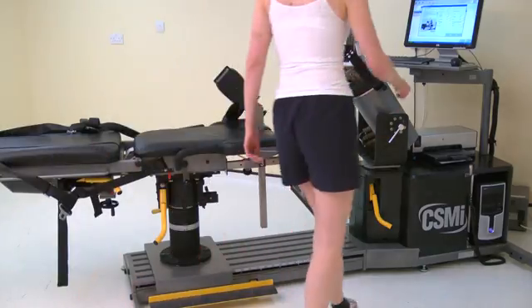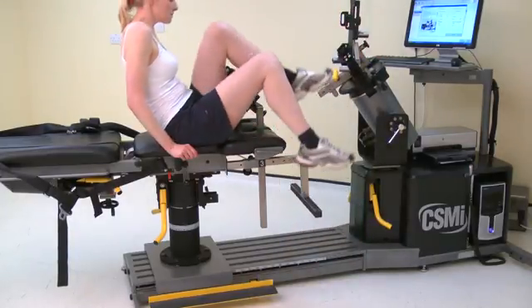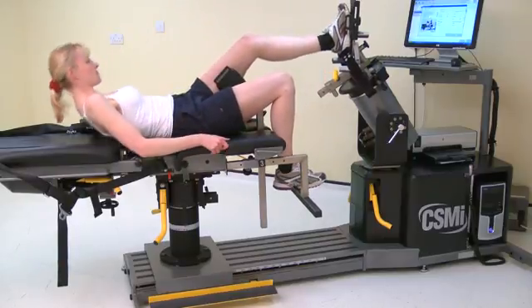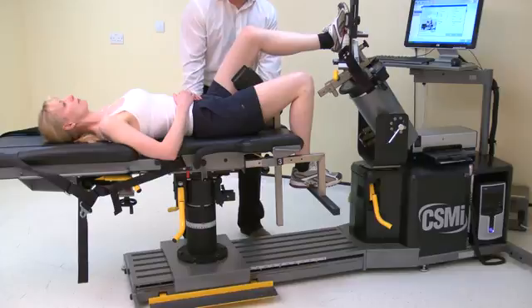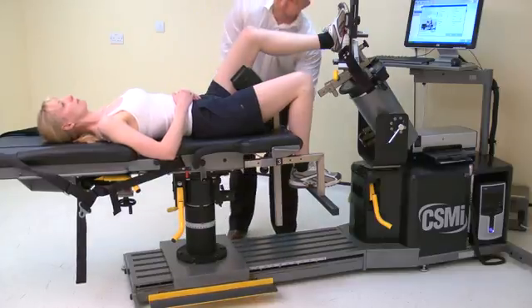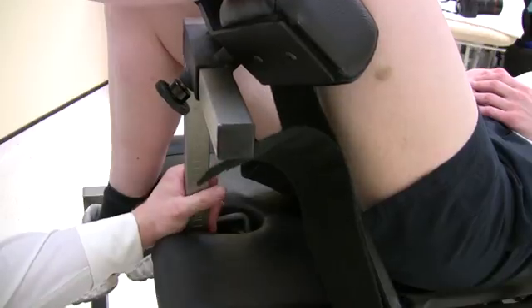Once the norm is positioned, ask the subject to lay on the chair. Adjust the monorail height and position of the thigh stabilizer until the knee is at the correct angle for the test. The stabilizer should be just above the posterior joint line, whilst also maintaining the knee in a straight line between the hip and the ankle.